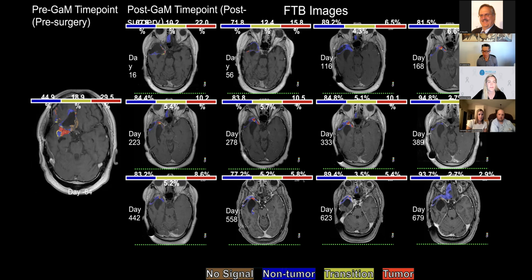If you do get a sequence from a 1.5T, it's not to say that it's not useful, but there may be some variability in terms of the actual 1.0 threshold. I think it will still give you, in general, a pretty good indication of areas that tend to be higher in rCBV. They're going to show up high, whether it's 1.5T or 3T. But for the greatest precision, and in keeping with what's been validated and published, 3T is generally preferred.